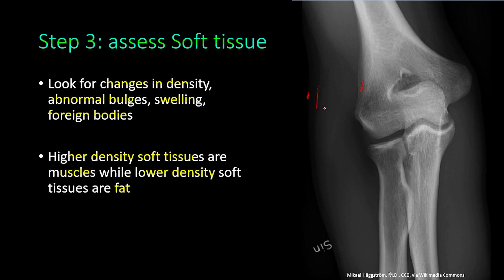On this AP elbow x-ray, the soft tissue is between the bones and the skin. A line is visible between the muscles, which have higher density and appear more white, and the fat and skin which have lower density and appear more black. Another line represents the area between two muscles with fat between them, and there is also some fat near the joint.